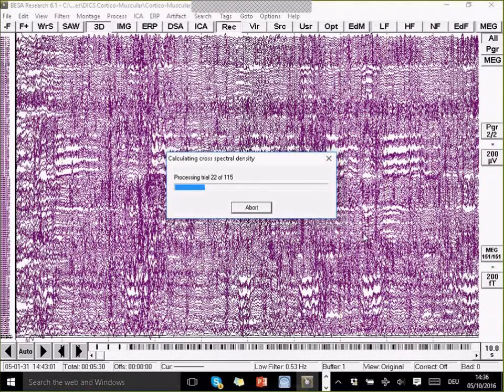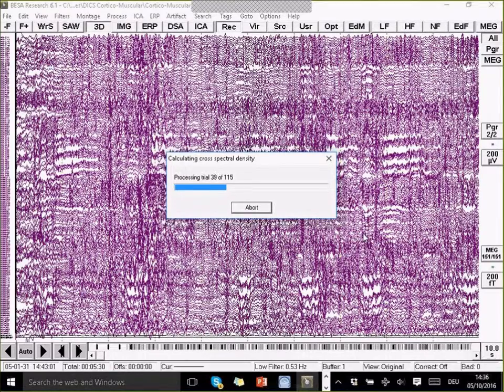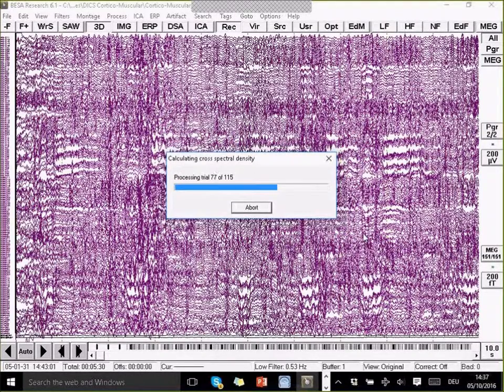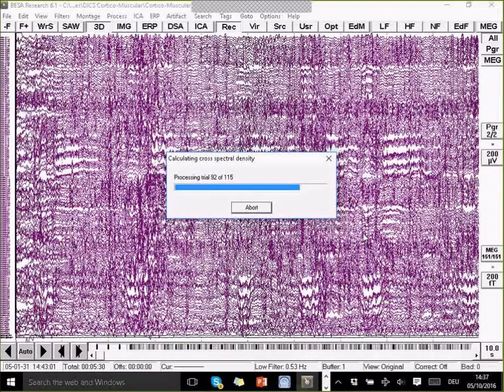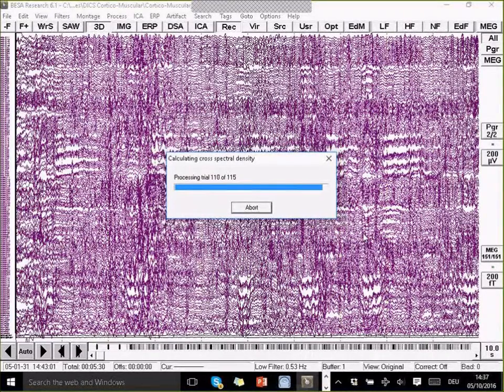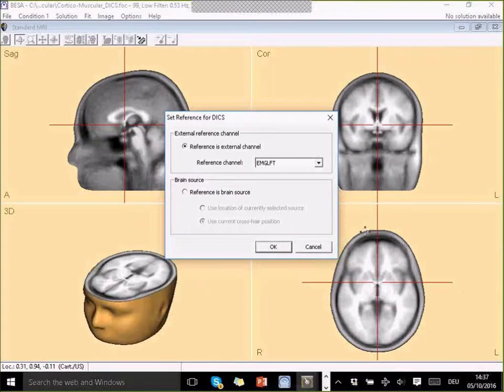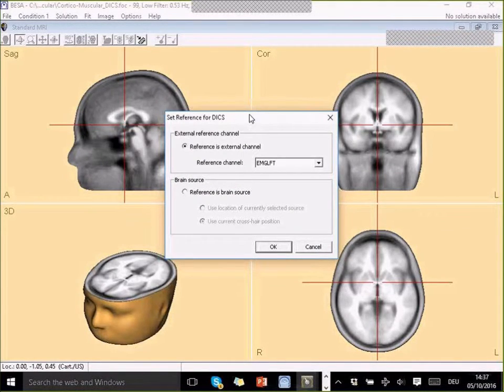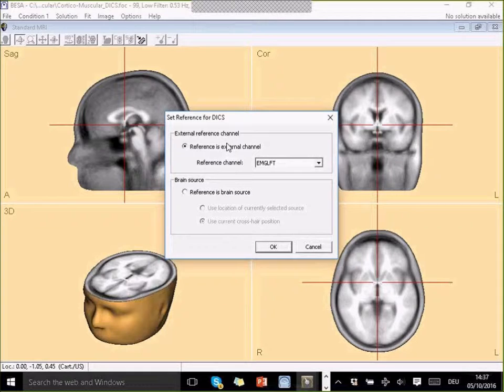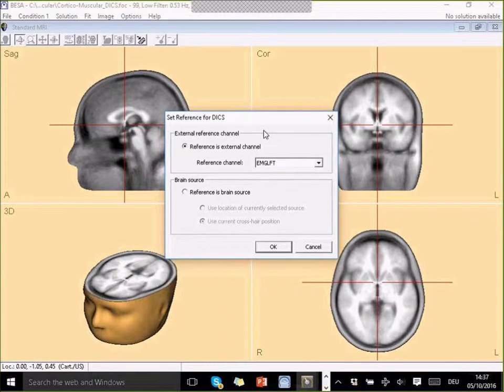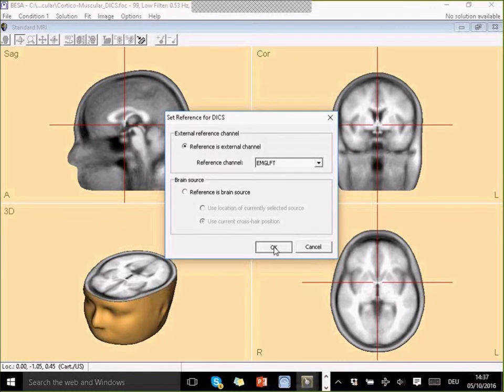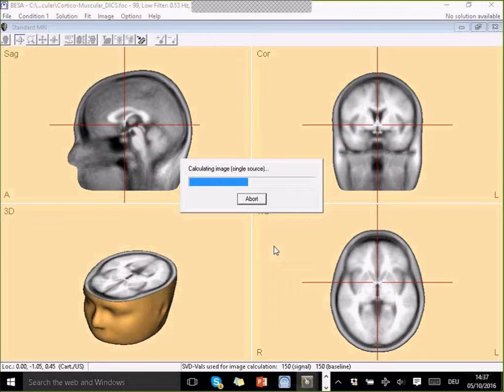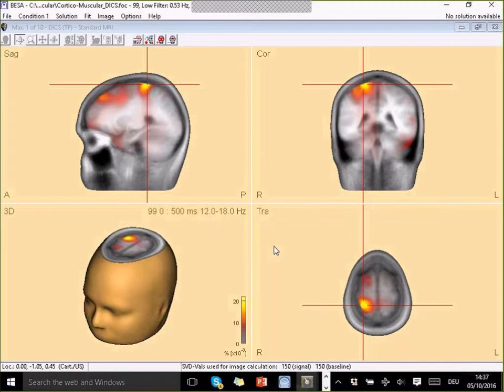And again, now it has to go through the dataset again to calculate this cross-spectral density matrix that is used for the DICS computation. I can now choose what my reference channel is for the DICS. In this case, because I'm looking for the coherence between the muscular activity that was measured with the EMG channel and the brain, I want to use this external channel as a reference. So okay. And now I get the DICS computation.